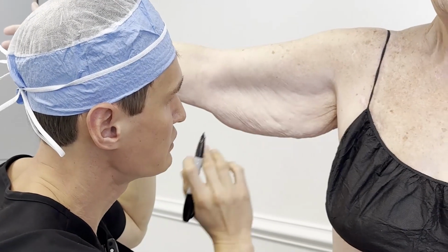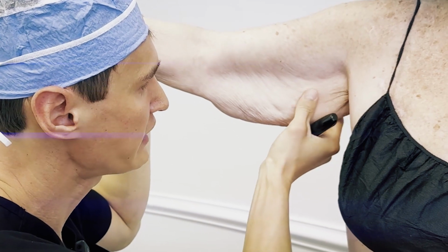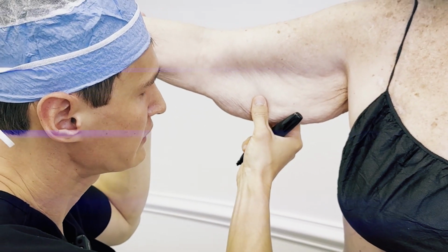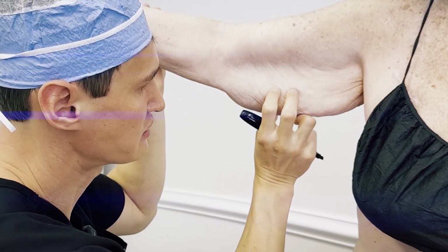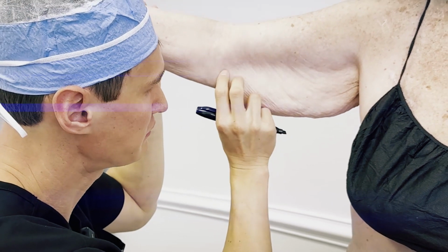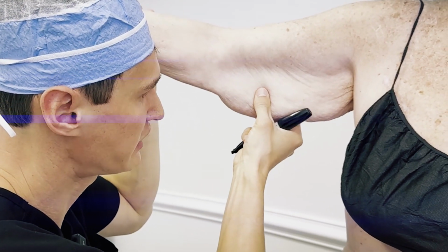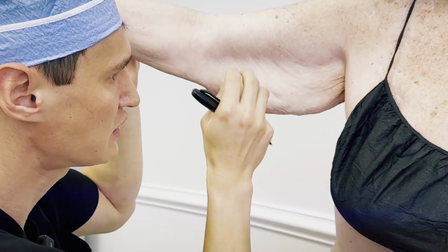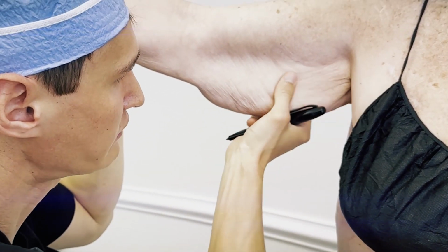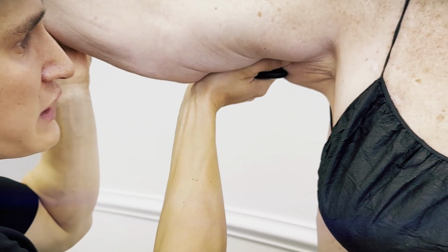So today we're doing a brachioplasty. A wonderful patient here has a lot of excess skin, but there's also fat. It's rarely one problem, rarely just fat or just skin. It's a combination of both. So we're going to do aggressive liposculpting, mostly here because she doesn't have a whole lot here, and after that we're going to remove that extra skin. It's going to look great.